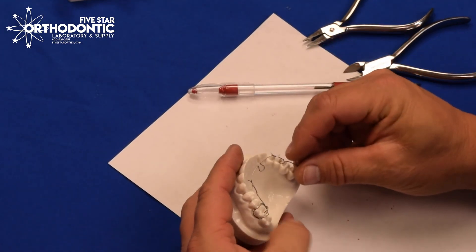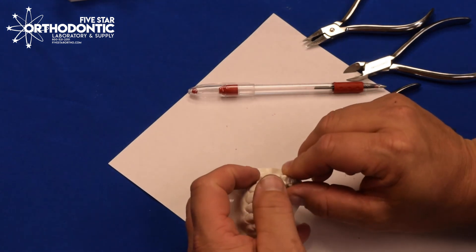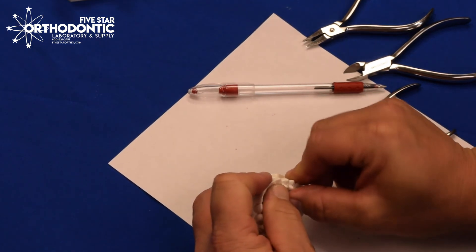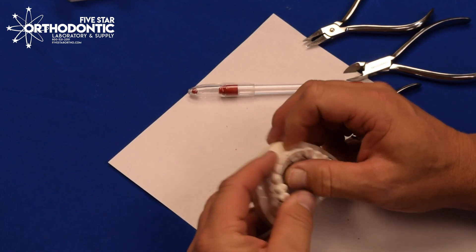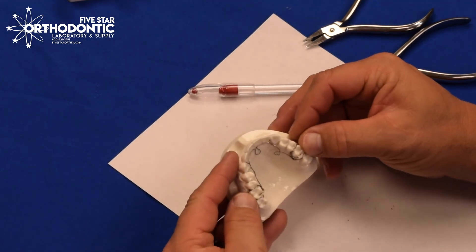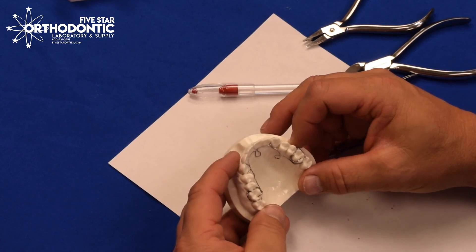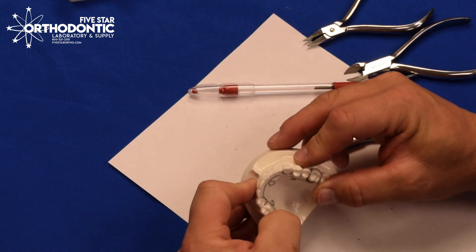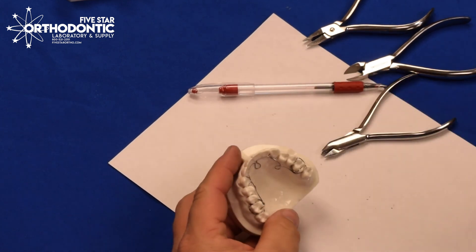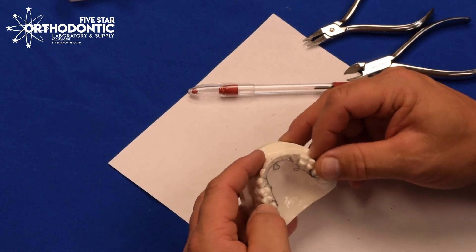After about one to two months, have the patient come back in, check your expansion, and measure the appliance in and out of the mouth — that'll tell you how much load to put on the appliance. If it's fully passive when they come back, activate an additional four to five millimeters. If there's five millimeters of load left on the appliance, you know they haven't worn it. But if there's only one to two millimeters of load, go ahead and add three to four millimeters.